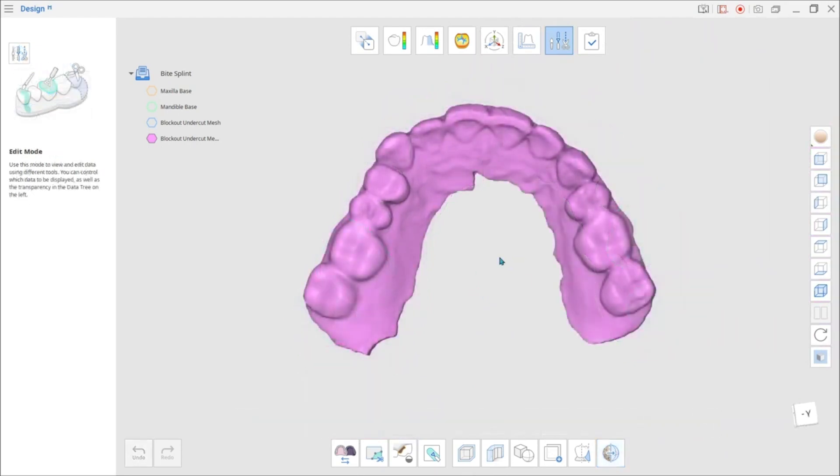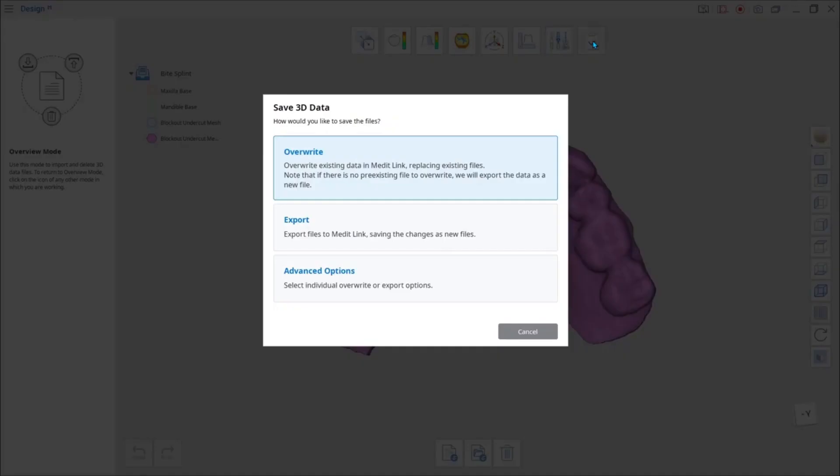When you're all set, click Complete to save the data. In the new dialog window, you will have three options. Choose Overwrite if you want to replace the existing file with a new one.